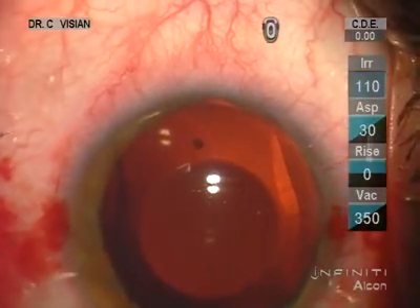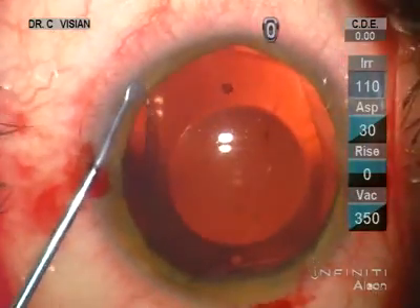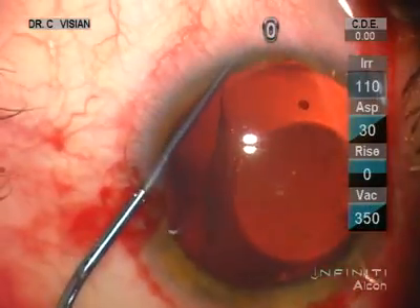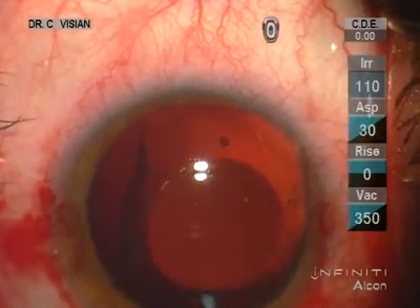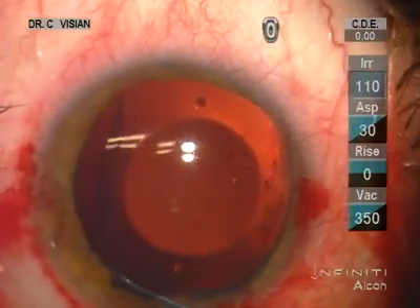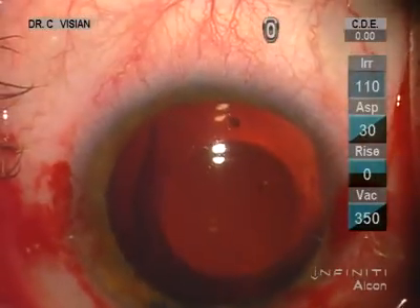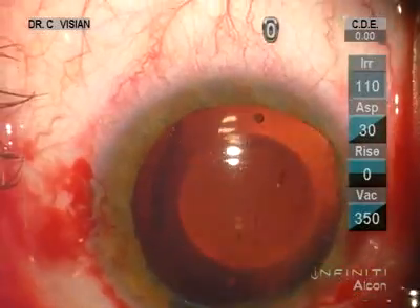We've tucked the leading right haptic, now we'll tuck the leading left haptic. And I like to tuck the trailing footplates through the large incision rather than the paracentesis.